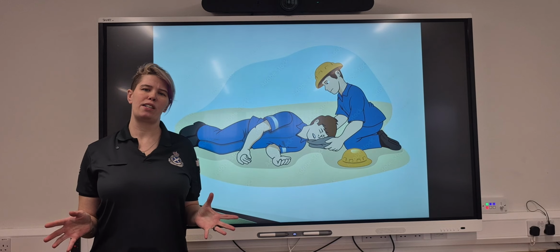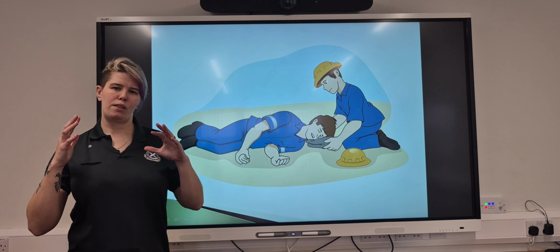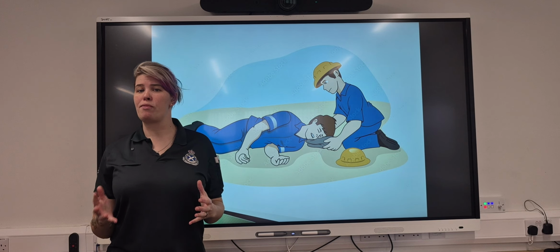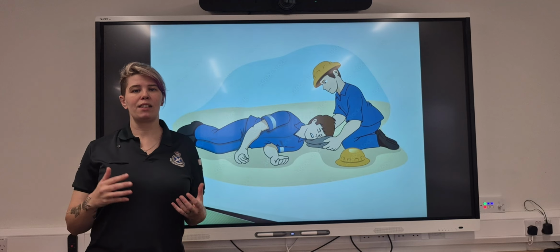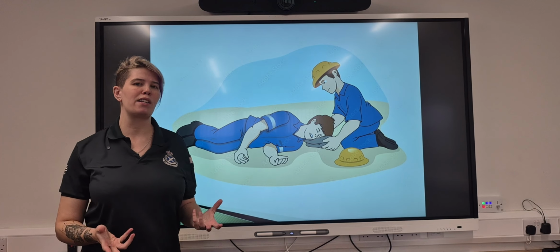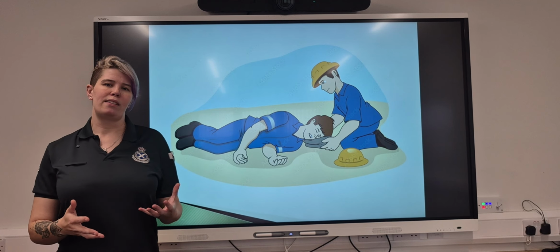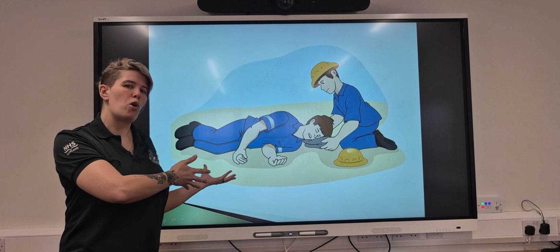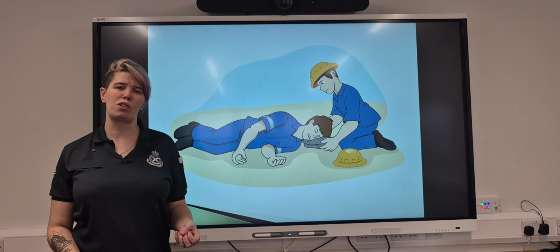That's how we suction. Just a little note here, guys. Again, we spoke about how sometimes the simplest method is the most effective. While we can clear an airway that's full of vomit very effectively and very quickly with the use of a suction kit, keep in mind that we can use postural drainage as well, and sometimes, to be honest, you're going to be just as quick.